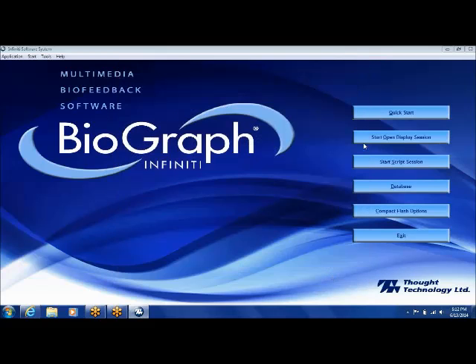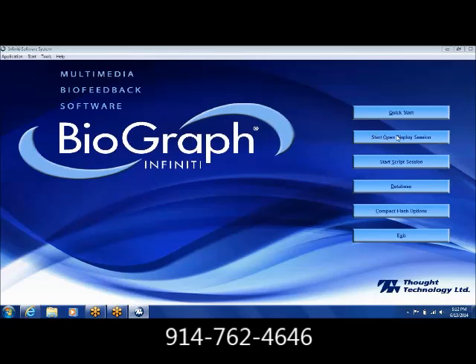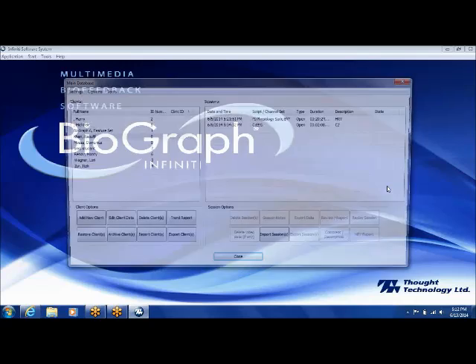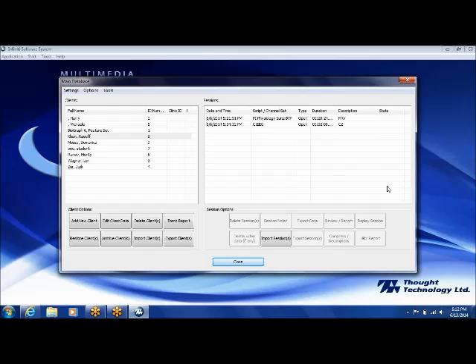I just wanted to show what the quick start looks like — I'll cancel that. Then you have your start open display session and your start script session. I'm not going to show either of those right now. I'm going to go to database. If I click on database, this is a way that you can either select a session you've already run or look at data that has already been recorded.